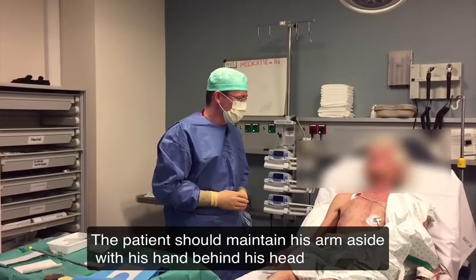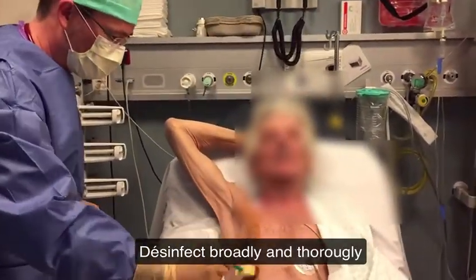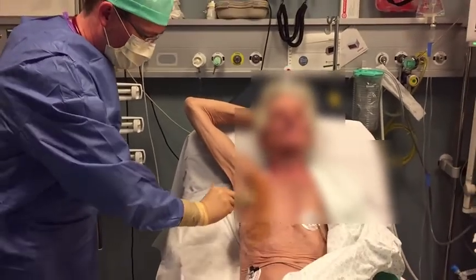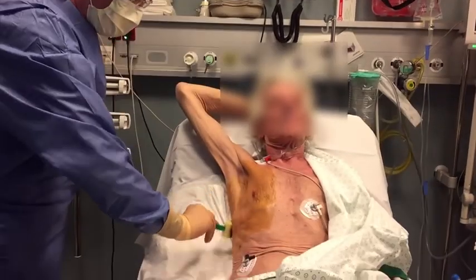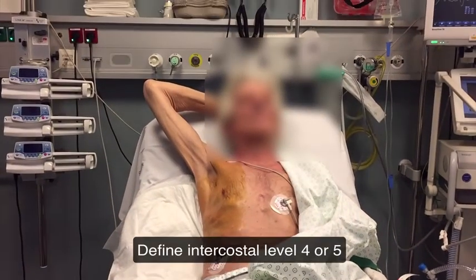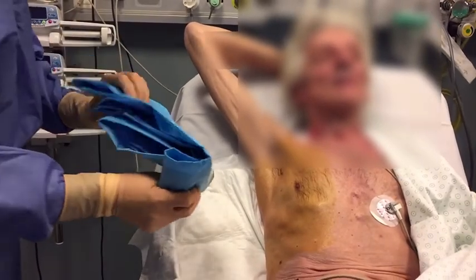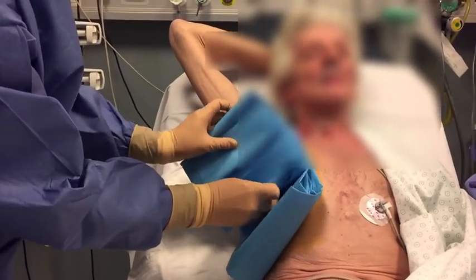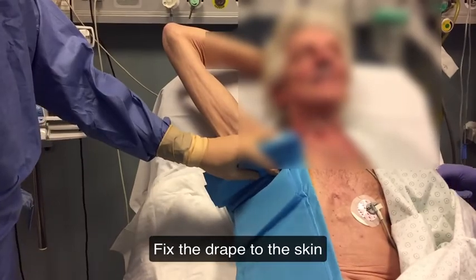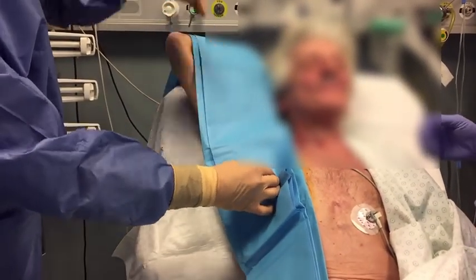The preferred patient position is half-seated with the arm lying aside and at shoulder level. Disinfect the thorax broadly to prevent desterilization. Before draping the patient, define intercostal level 4 to 5 to place the chest tube. Preferably use a broad sterile drape with a central opening.